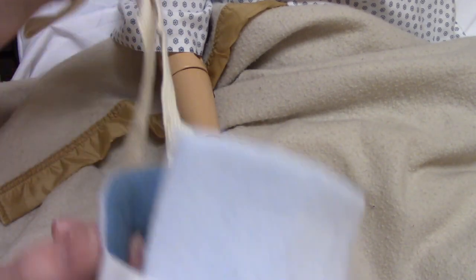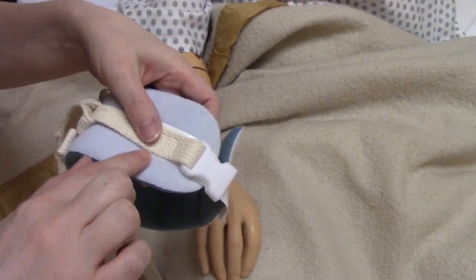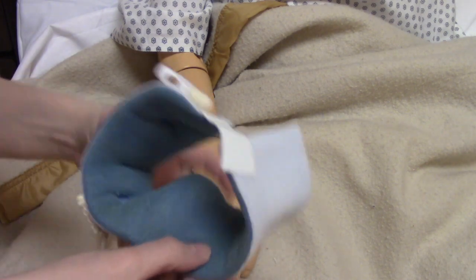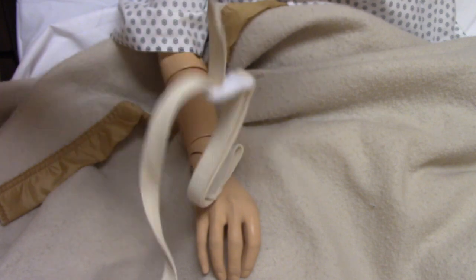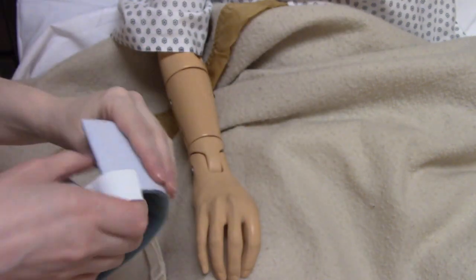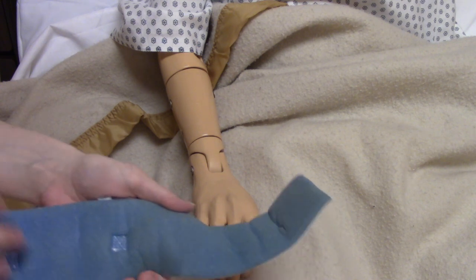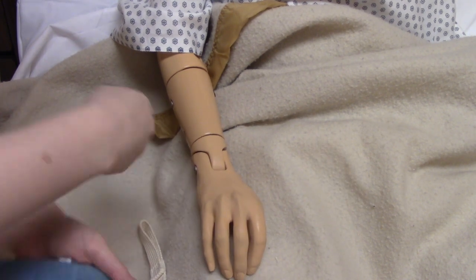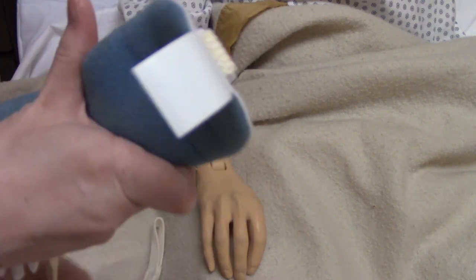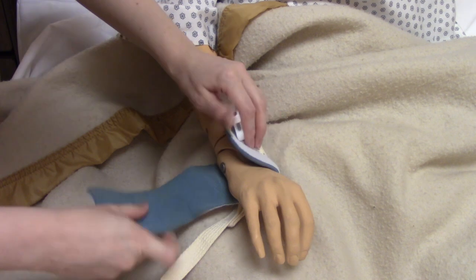So if you've seen these before, this is kind of what they look like. There's white on the outside and the inside is blue, and then it has the buckles and the straps. To put it on the patient's wrist, the blue side — which is considered the softer side — goes and touches the patient's skin.